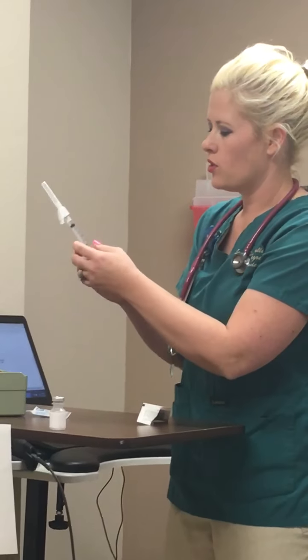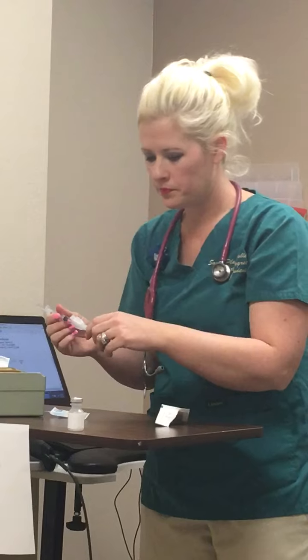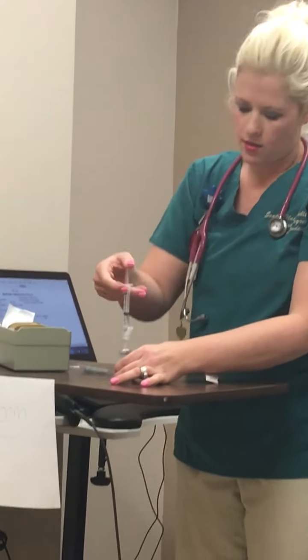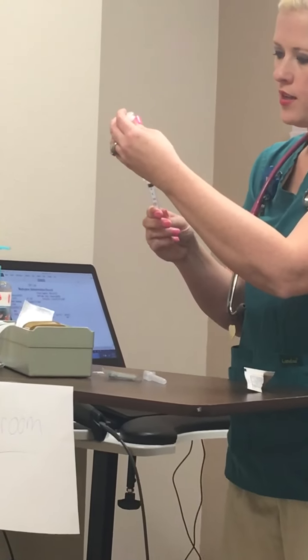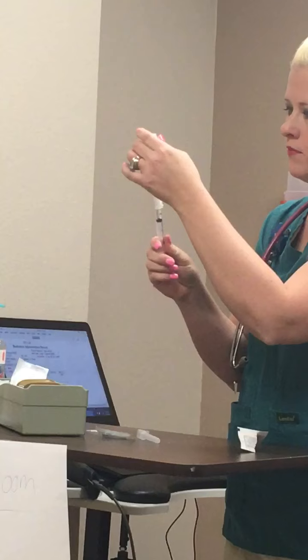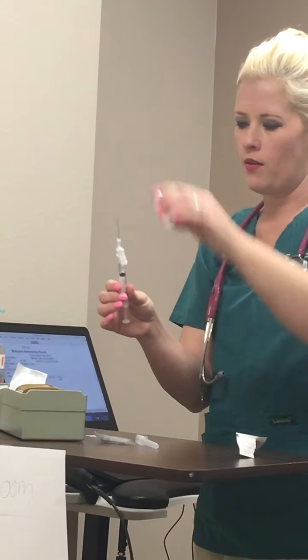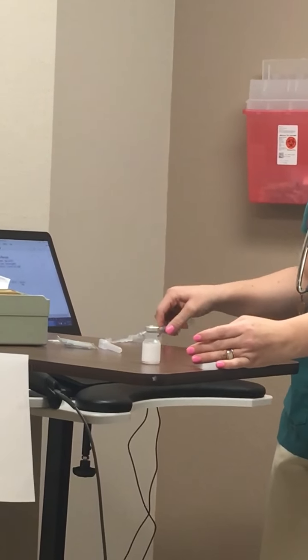I know I'm giving 1 mil, so I have to pressurize my vial. So I'm going to pull up 1 mil. I'm going to inject this into my clean vial, pressurize, and I'm going to pull up 1 ml. So I pulled up 1 ml. I'm going to take it out. I'm going to activate my safety device so I don't poke myself.